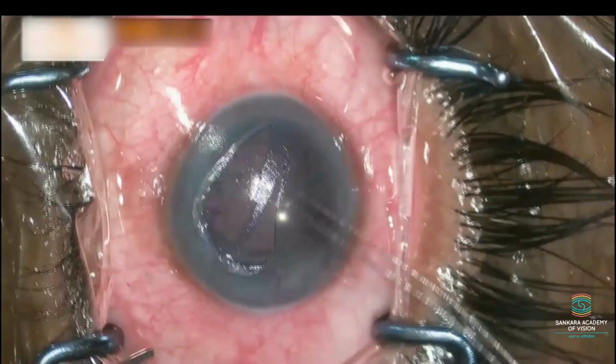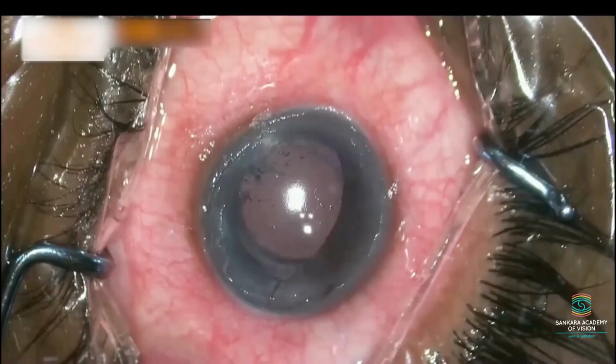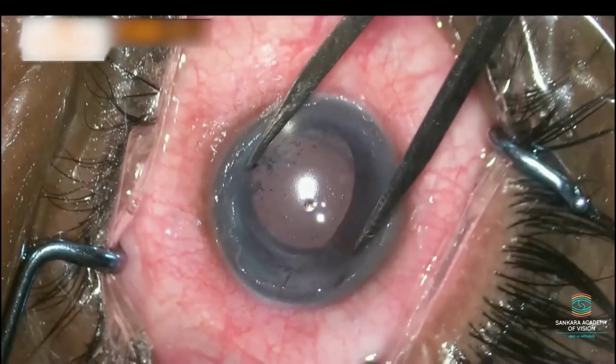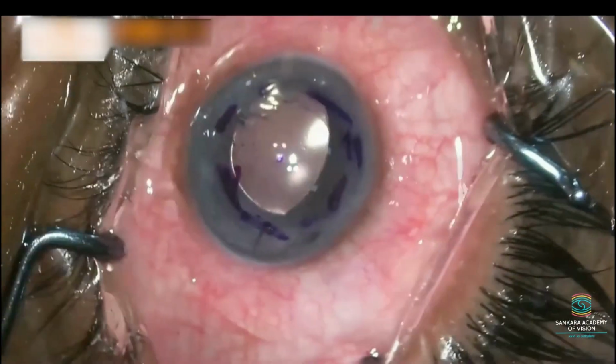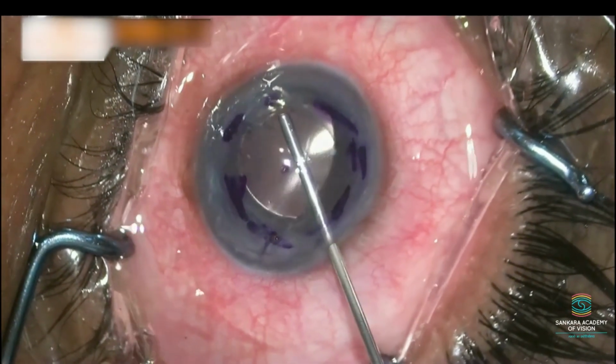Epithelial stripping is performed using a scraper to improve the view of antechamber. Centration is marked and 7 mm marking is done using a caliper. Using a 2.8 mm keratome, a corneal incision is made. Viscoelastic is injected to inflate the antechamber.